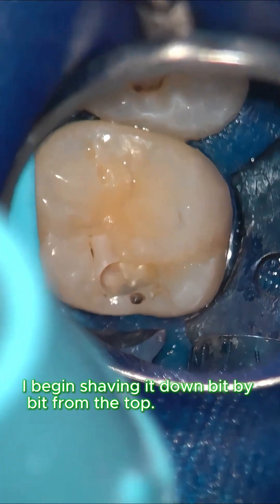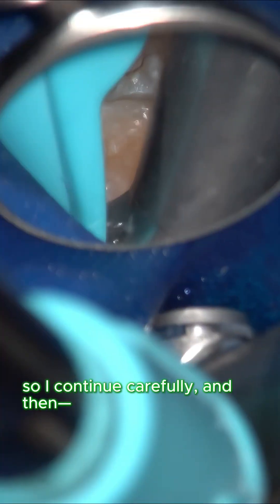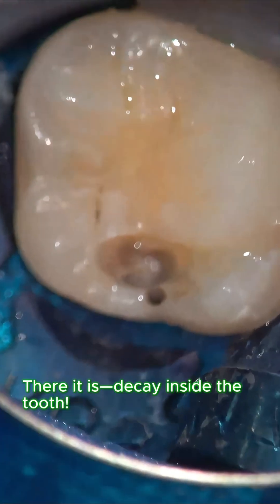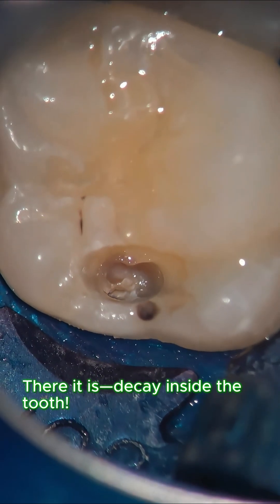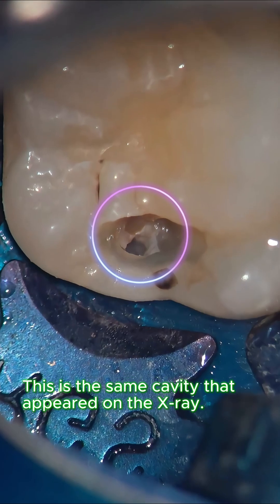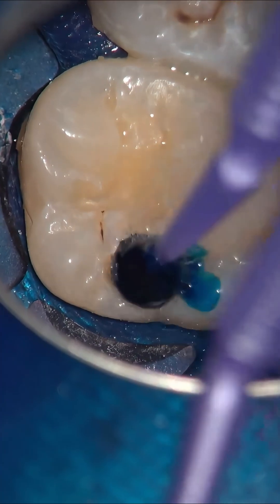I begin shaving the tooth down bit by bit from the top. This area looks slightly white, so I continue carefully — and then there it is: decay inside the tooth, the same cavity that appeared on the x-ray.